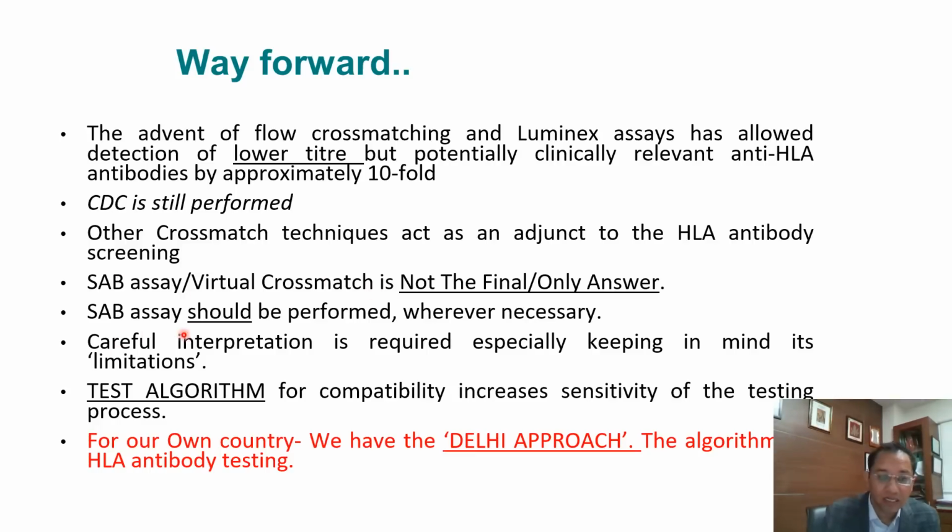So single antigen bead assay should be performed wherever necessary, but it requires careful interpretation, and you should understand that it is not the final answer and you need to know the limitations of single antigen bead assay. We should have a test algorithm for compatibility to increase the sensitivity and the specificity of the testing process. So you can have a battery of tests, where this is what I'm going to employ initially, and then if this comes positive, I will go for this test.